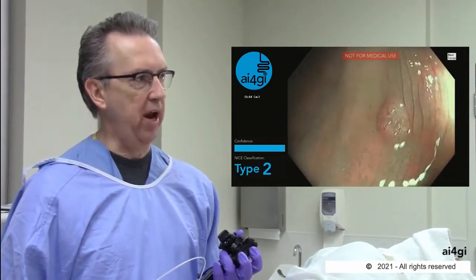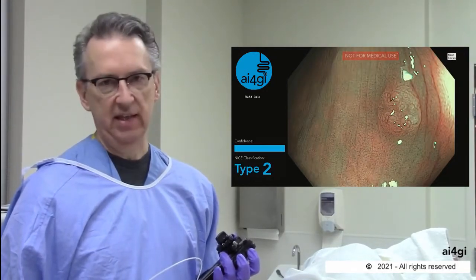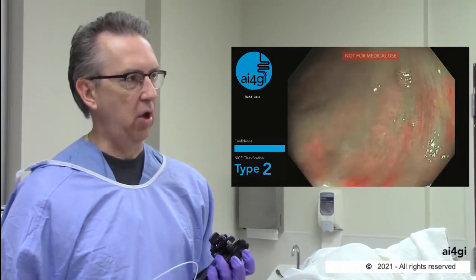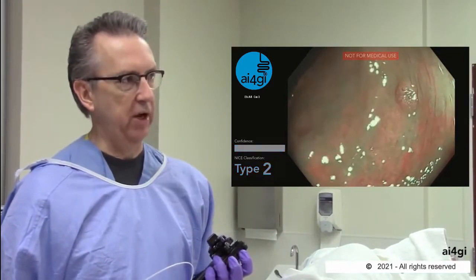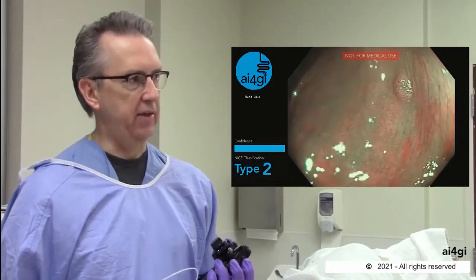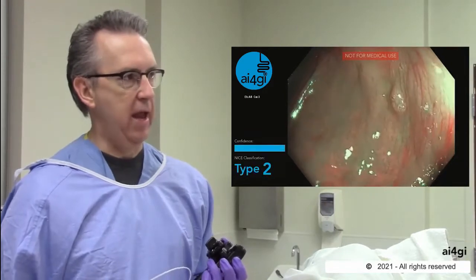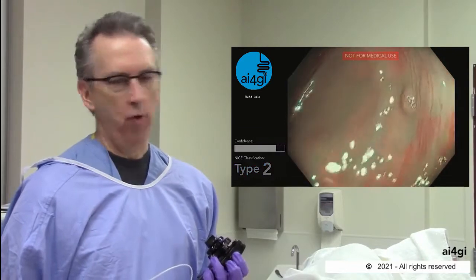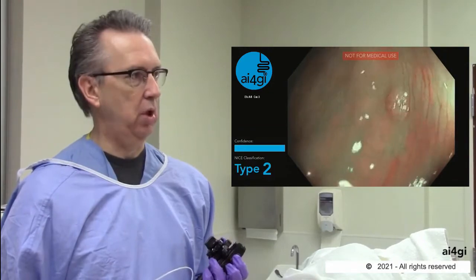You can see that the program is really immediately developing high confidence that this is a type 2 lesion. It'll do it either in near focus or in standard focus from a little greater distance. So this would be a great candidate if we actually could perform resect and discard. This lesion has basically zero chance of having cancer in it — we could remove it and throw it away. It demonstrates nicely the performance of the model with a high-confidence diminutive type 2 lesion.